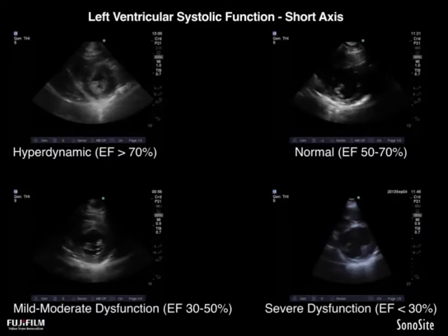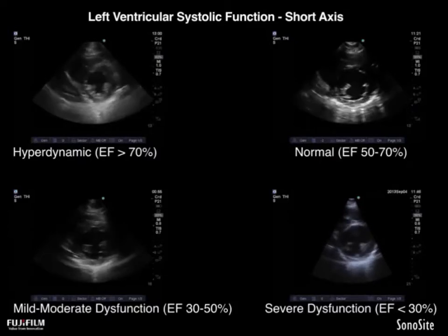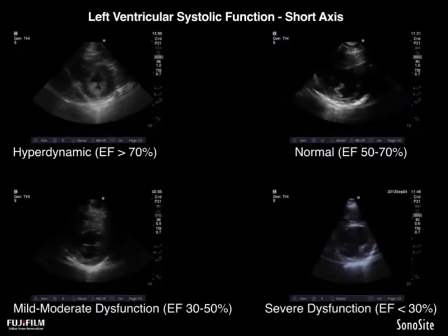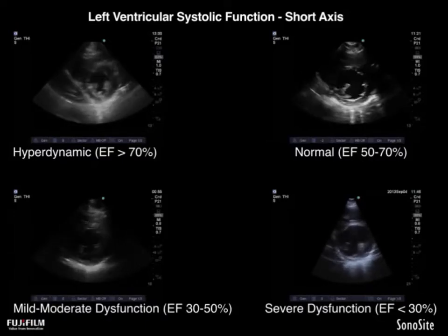The absence of the mitral valve in a long axis to help us with the EPSS does make it an assessment based just on excursion and thickening, which may challenge the novice. However, with sufficient practice, this is easily overcome.